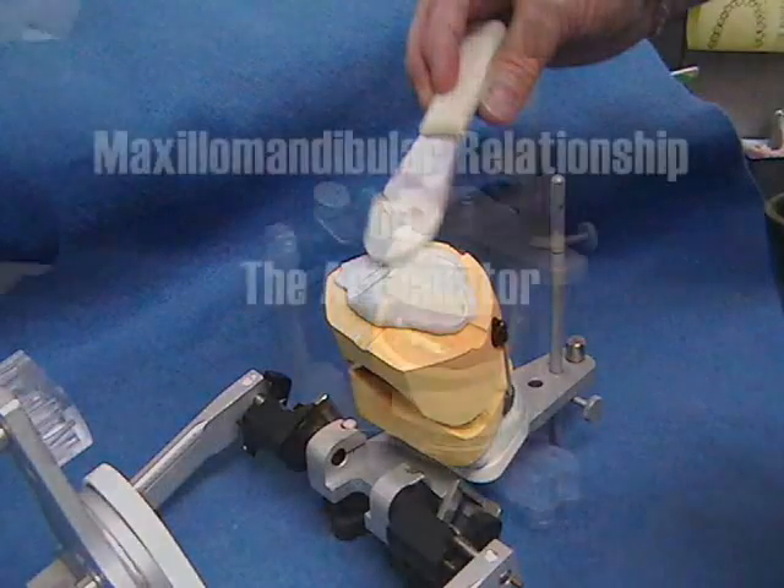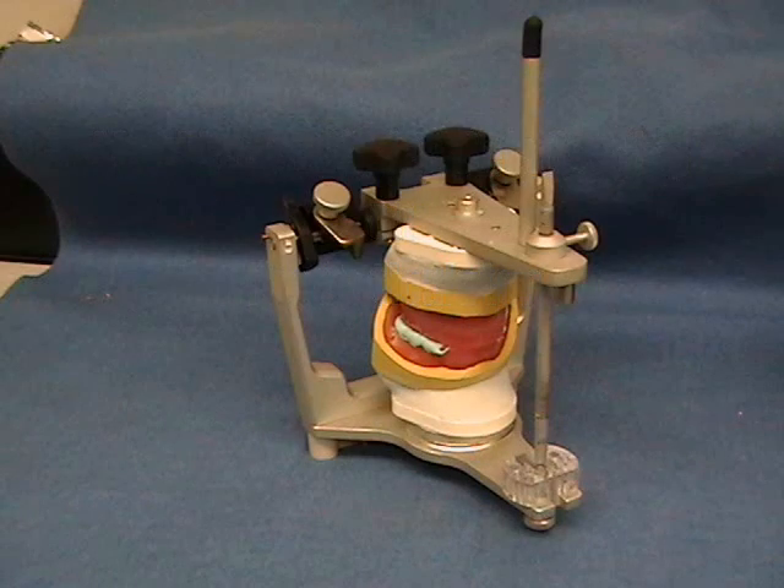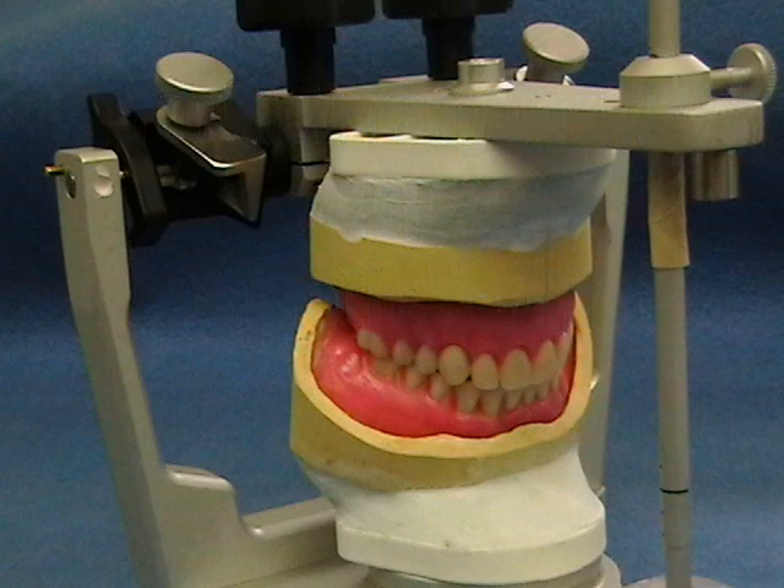The casts and articulator are prepared for submission to the dental laboratory. A work authorization guides the technician in fabricating trial dentures for evaluation in the patient's mouth.